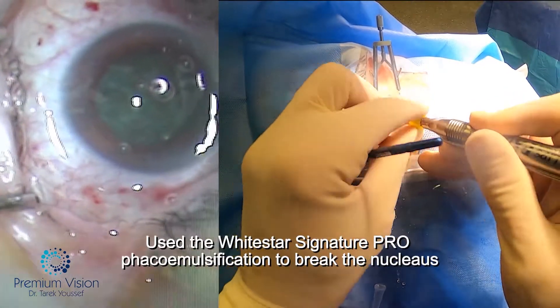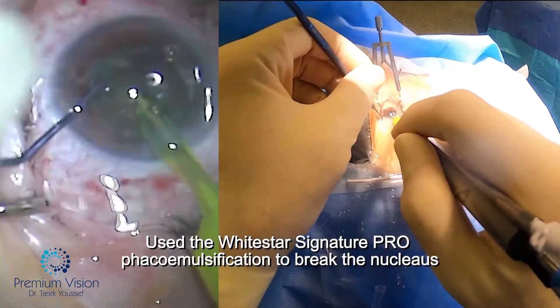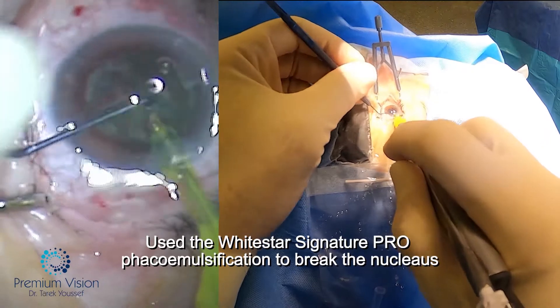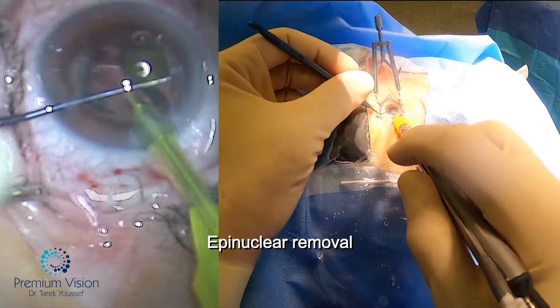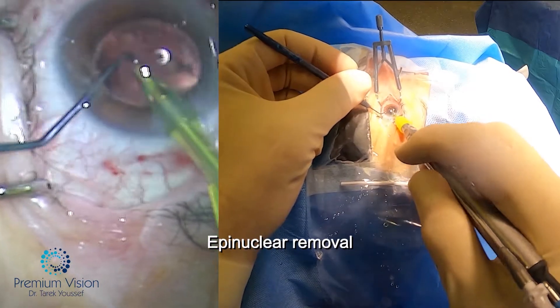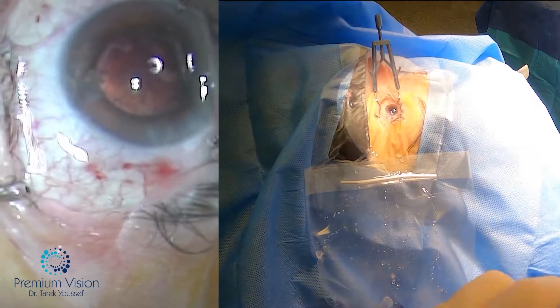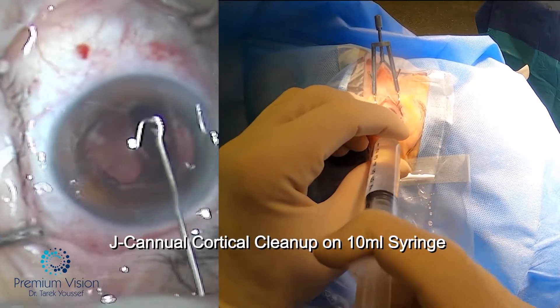The capsule is already done, so we're just going into FACO now. The nucleus is already divided by the laser, so we just have to remove the different pieces, leaving the epinucleus till the end to protect the capsule. After that, we'll do the J-cannula cortical cleanup, which is the safest way to do the cortical cleanup.